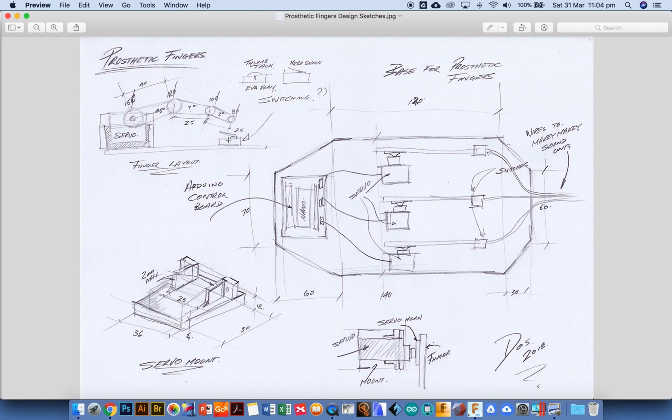I've sort of given myself some rough ideas. These measurements are just guides at the moment because I will probably change some of them to fit models when they don't fit later. So I've sort of looked at a 15mm circle, 12, 10, 8. Distance between 25, 25 and 40. Now the line that would run down the middle of this finger, so if I imagine I joined up all those circles, that line is going to control the shape of the finger. So working on these measurements, let's go back to Fusion.